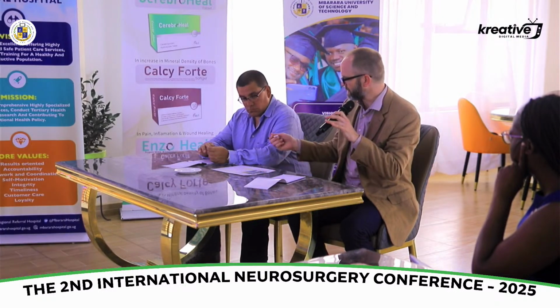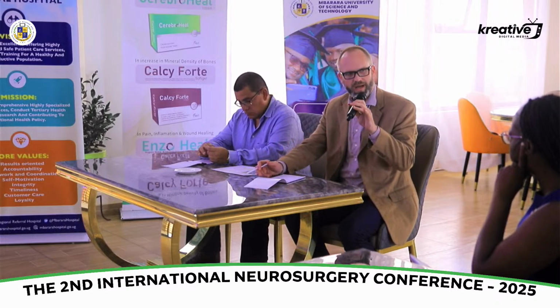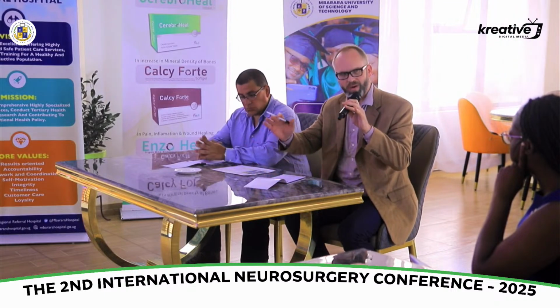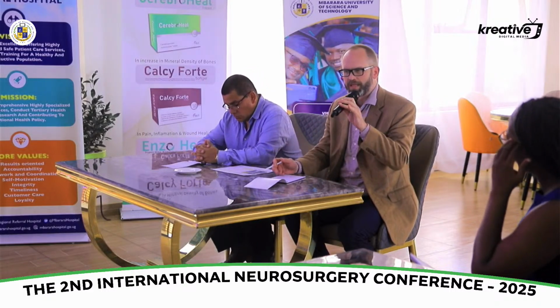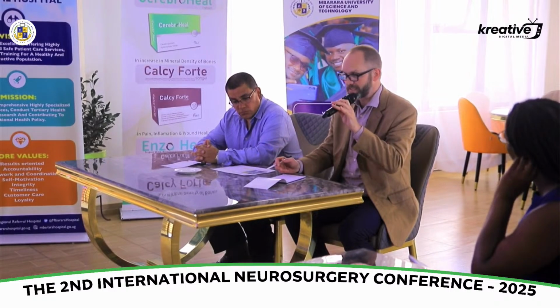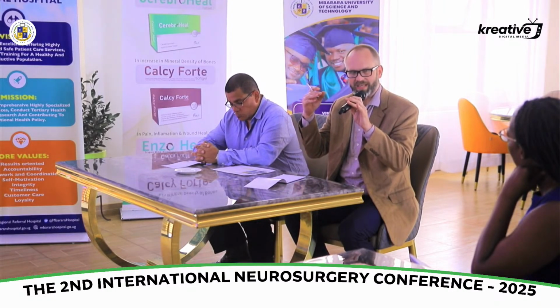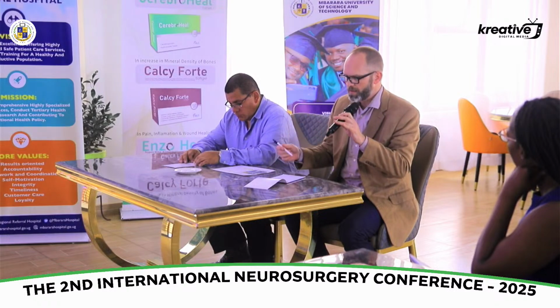ICP measurements I'm going to leave to Dr. Kava, because the most important way to measure ICP, or at least indirectly measure ICP, is with transcranial Doppler and some of the indices with transcranial Doppler. So you don't need the bone off. You use windows of bone through which you can see through with vascular imaging, like the temporal window. But he'll talk about that.